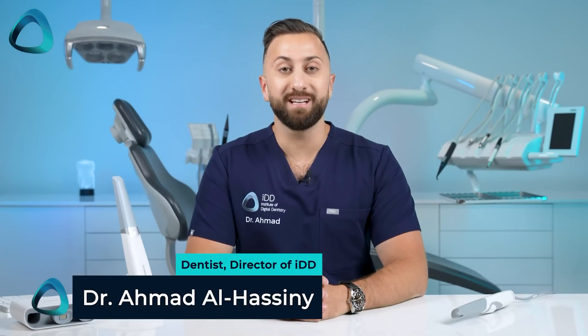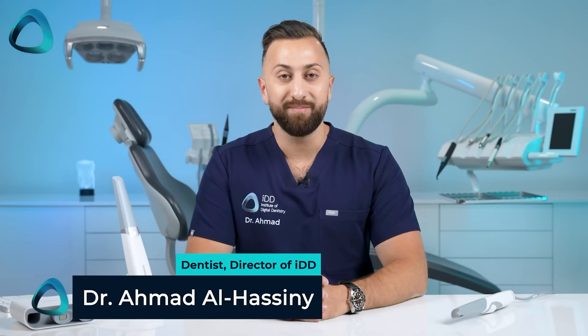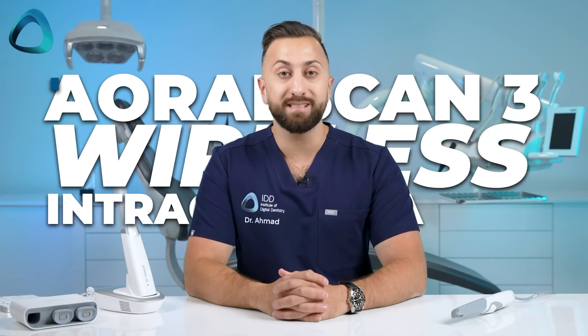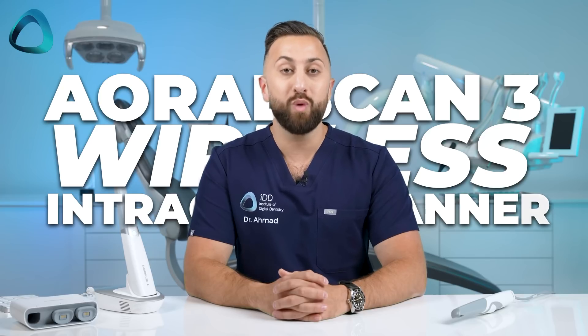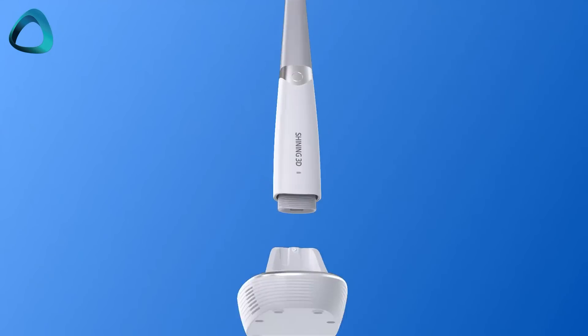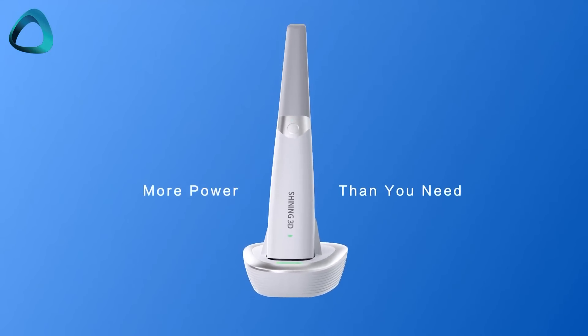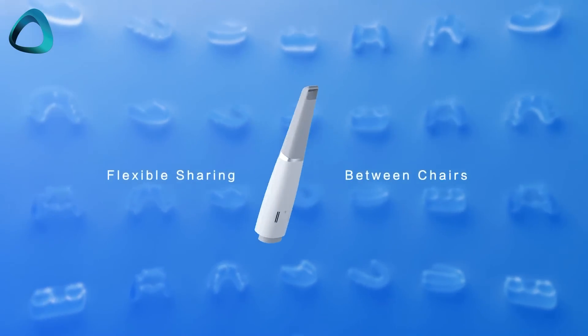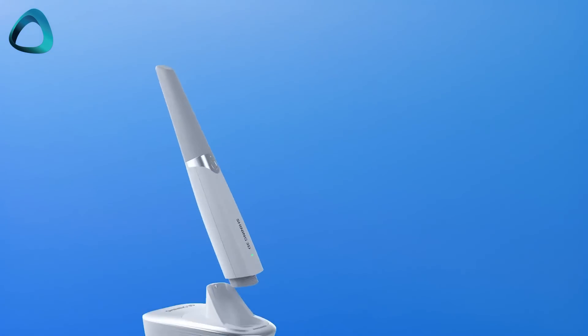Hey guys, Dr. Ahmad Alhasni here from the Institute of Digital Dentistry. Today I wanted to go over a full review of the Aoralscan 3 wireless intraoral scanner, which we have been testing here at IDD for over a year now. Shining3D, the company behind the scanner, has been busy updating their software to make the scanner competitive in this market. They have released some interesting new features, which I wanted to share with you in this review.